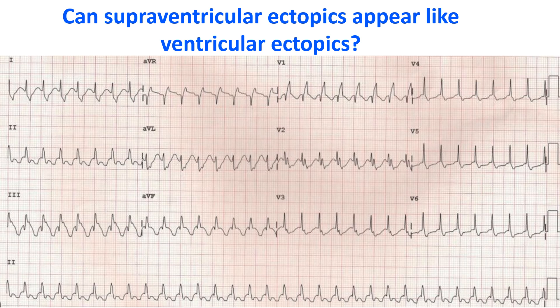Supraventricular ectopics usually have a narrow QRS complex with a duration less than 120 ms. But when conduction down to the ventricles is abnormal, as in a pre-existing bundle branch block or a transient conduction block induced by prematurity, the QRS complexes can be wide and mimic a ventricular ectopic beat. A preceding P wave, if present, may indicate the supraventricular origin. It is also possible to have a ventricular ectopic soon after a sinus P wave which appears in a similar way. This ECG shows supraventricular tachycardia with aberrant conduction having right bundle branch block morphology.